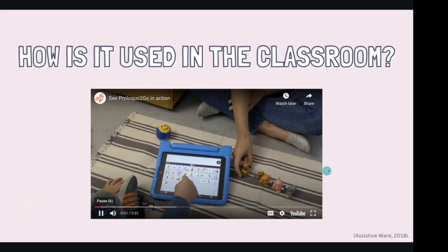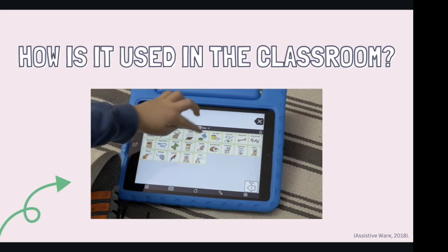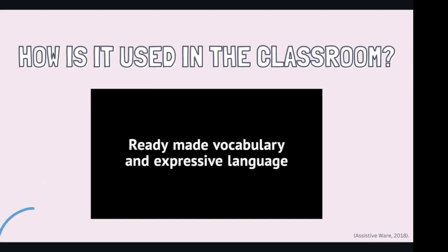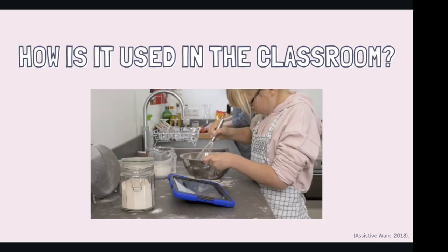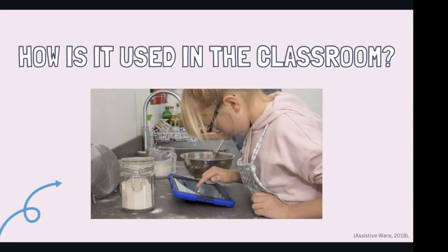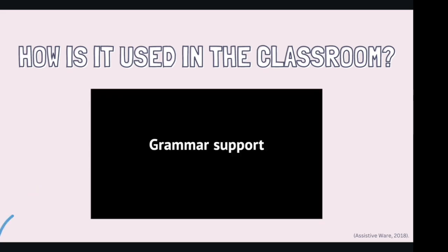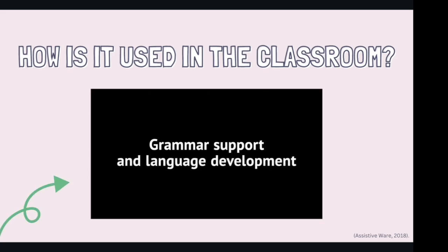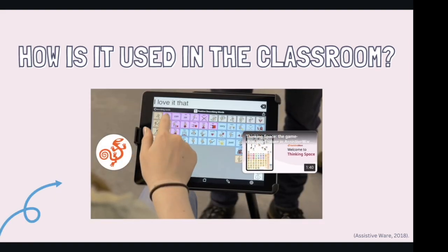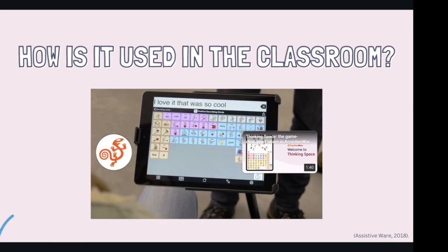My name is Tommy. Dog. Woof, woof. My name is Rose. Hand mixer, give. Me. Hand mixer. My name is Emily. I love it. That was so cool. I love it.